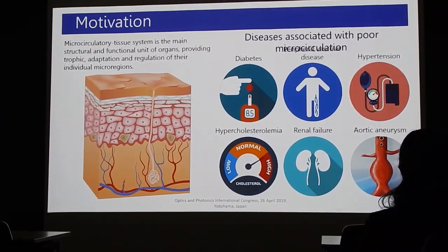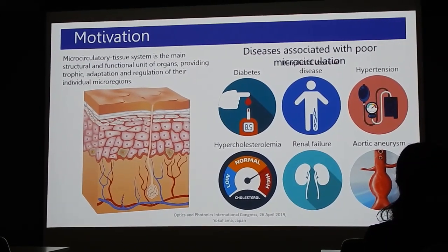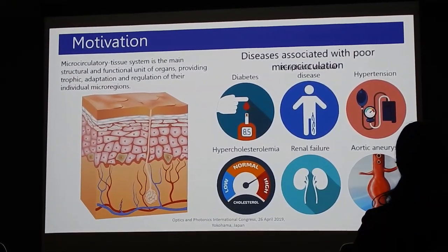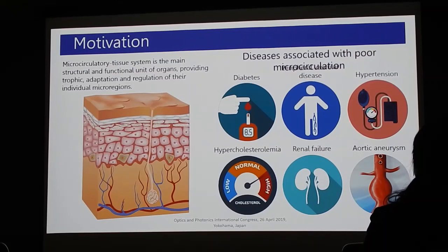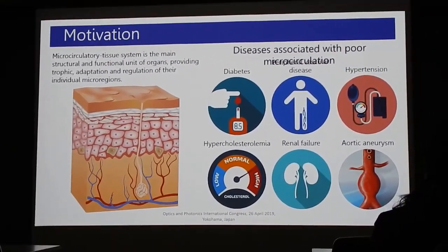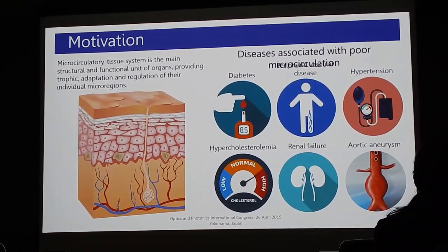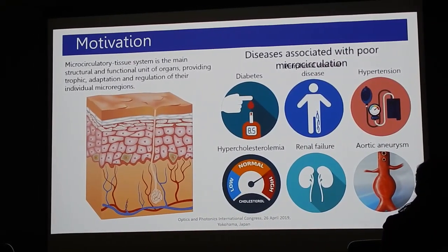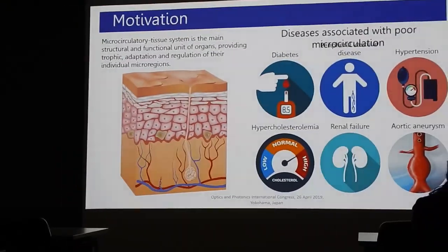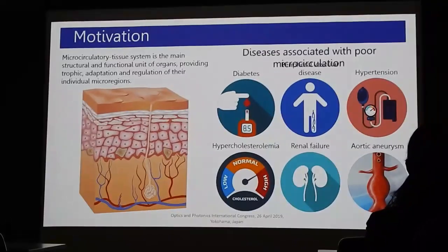The microcirculatory tissue system is the main object of the study by Doppler Flowmetry. It's a complexly organized system that exchanges between blood and tissues, necessary to provide tissue metabolism and removal of metabolic products. The microcirculatory tissue system is the first link in many critical conditions, and that's why it's so important to evaluate its functional state.